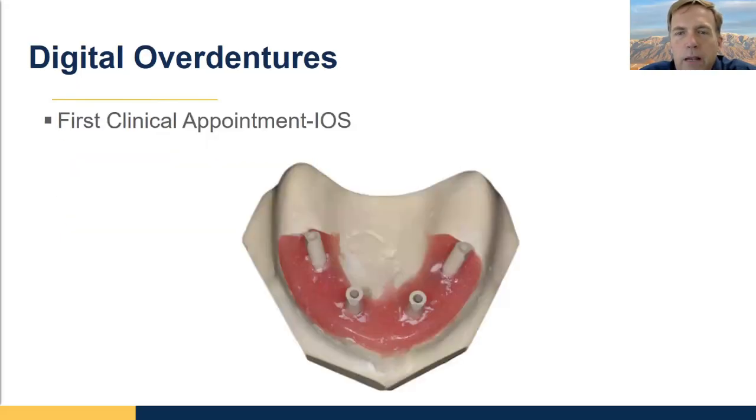So your first appointment is going to be a fixture level impression with scan bodies. So what you want to do is find the correct scan bodies for whatever implants you have and do a nice full arch scan. All you have to do is scan the master arch. If it's a single arch case, you can scan the opposing at this time as well, but you won't be taking the bite. We'll be taking the bite with a bite block.